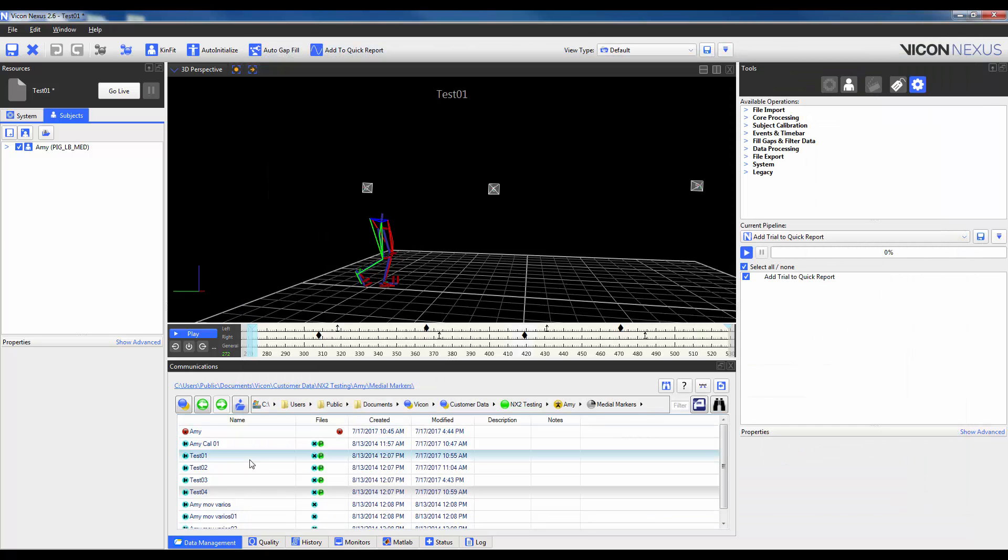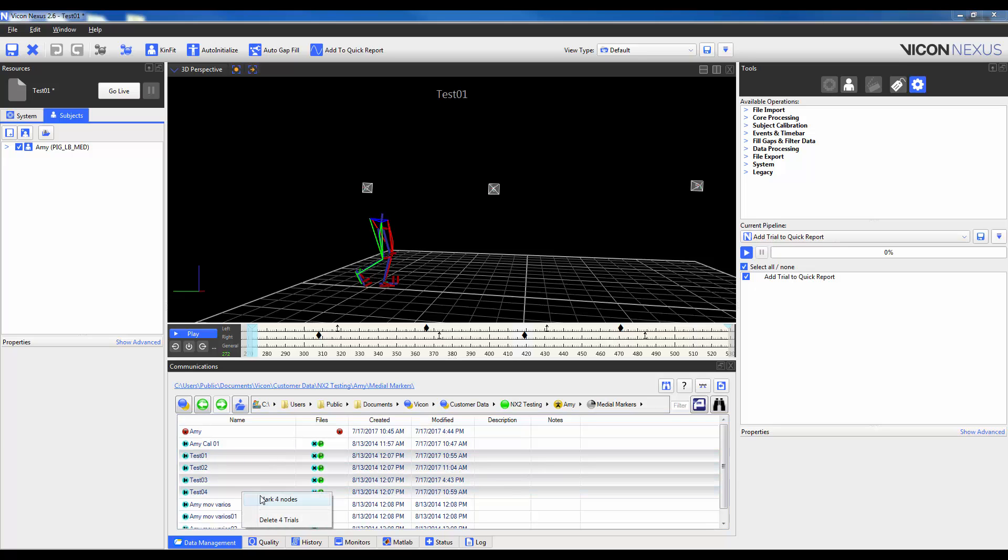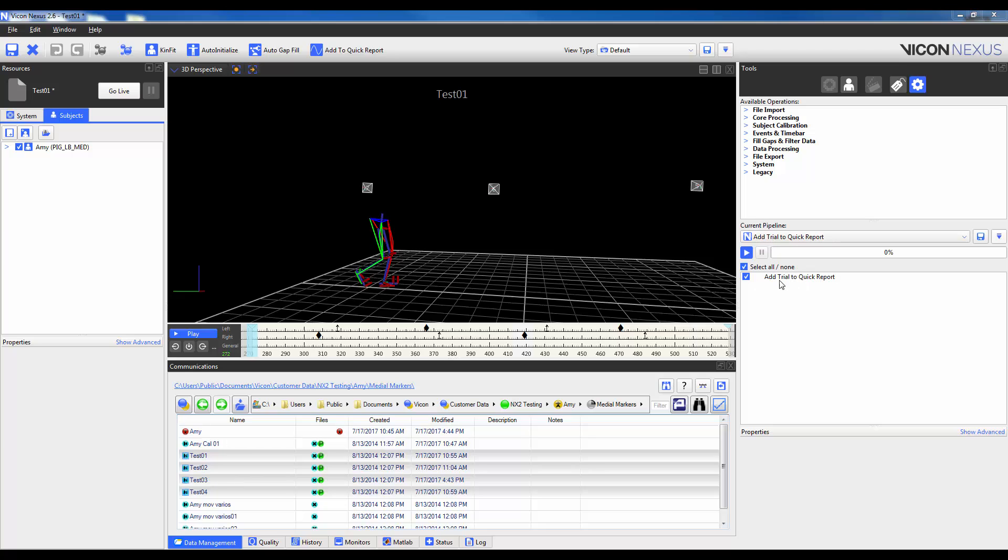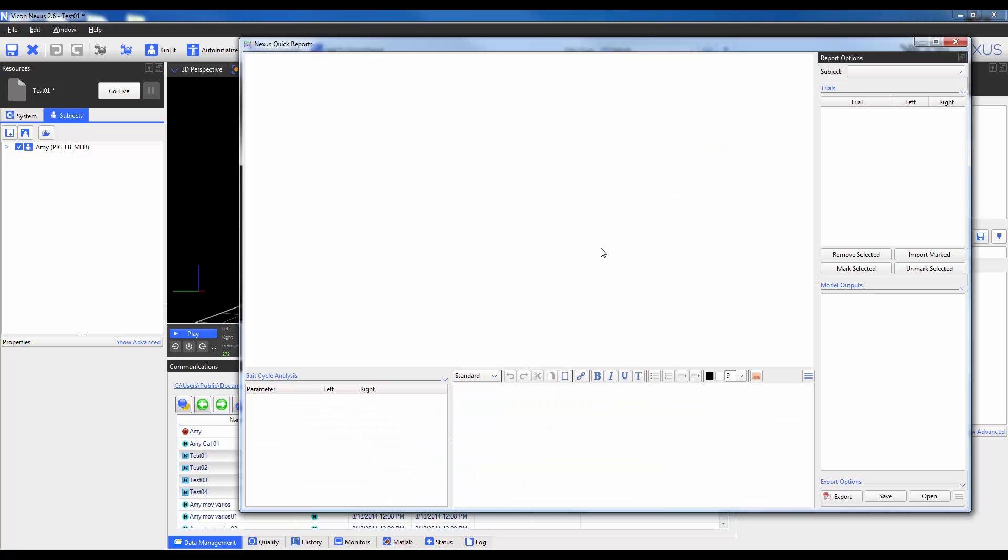The second method involves marking the trials within your data management. So I've highlighted four trials. I'm going to right click and mark four nodes and I can either run a batch process that again includes this pipeline operation or I can go ahead and open quick reports and select import marked.